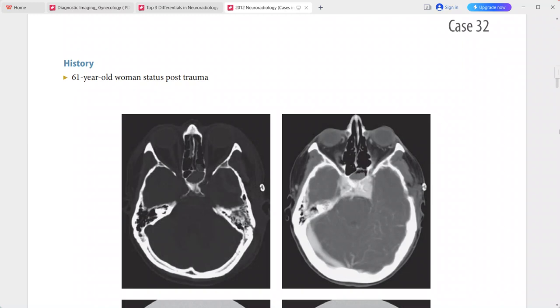Case 32: a 61-year-old woman, status post trauma. On CT we can see fractures of the basisphenoid and the left temporal bone.